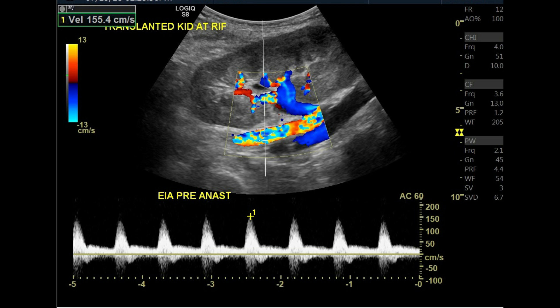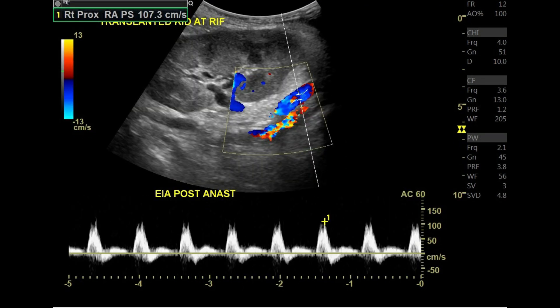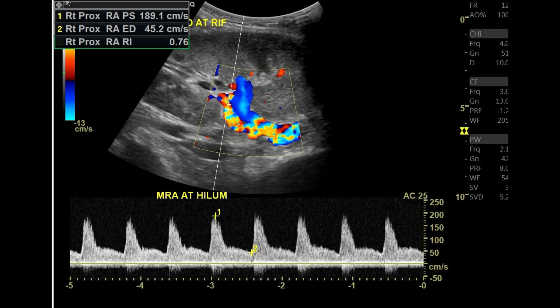The velocity pre-anastomosis is 155 cm/s and post-anastomosis is 107 cm/s. If the velocity at the anastomosis is triple that of the pre and post anastomosis values, it indicates stenosis. In this case, it is considered normal. After that, we scan the main renal artery at the hilum.